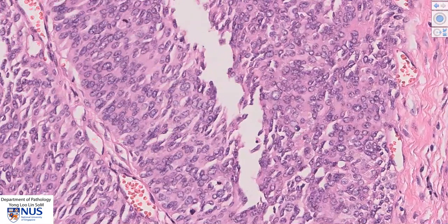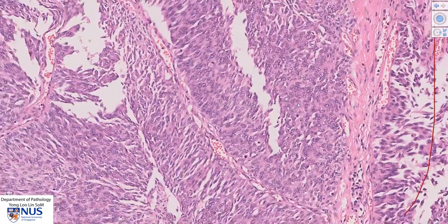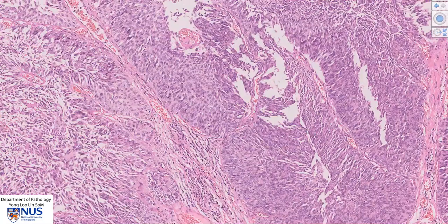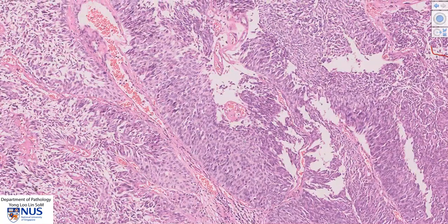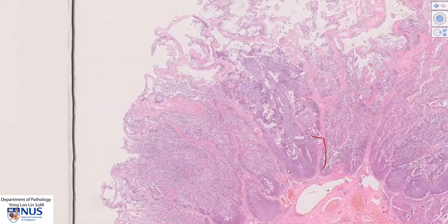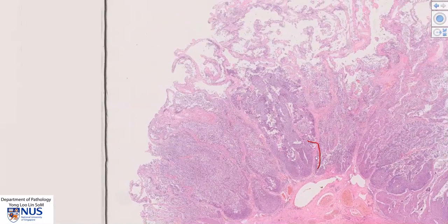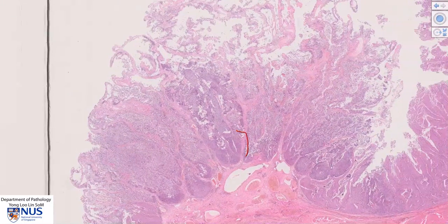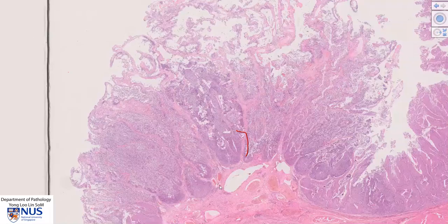There is another mitotic figure here which is quite close to the surface of the epithelium. In general, this area shows more architectural disruption and more nuclear atypia. So overall, this is a high-grade papillary urothelial carcinoma.